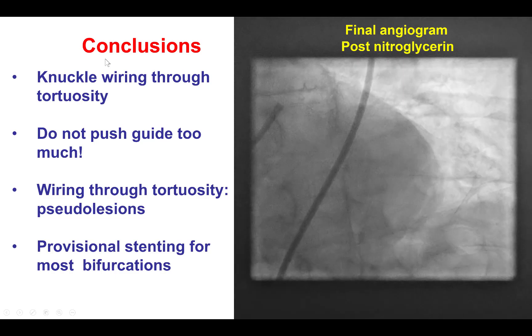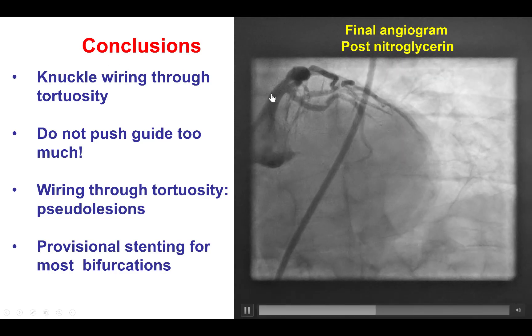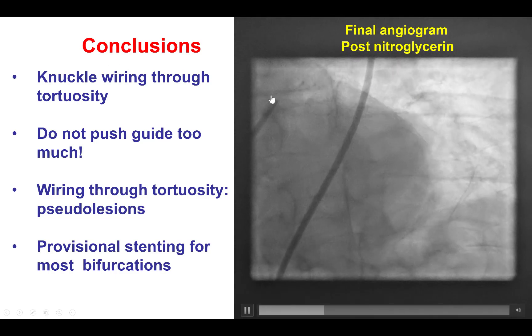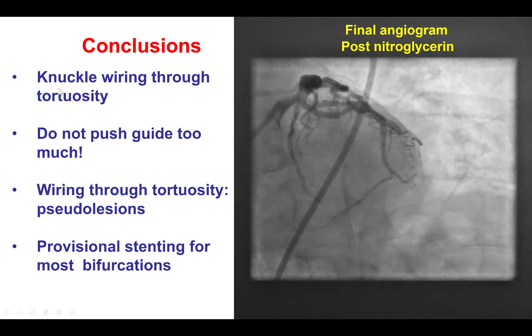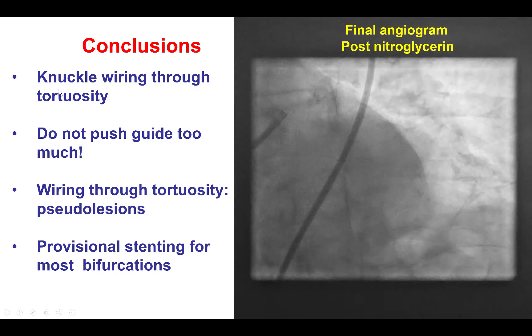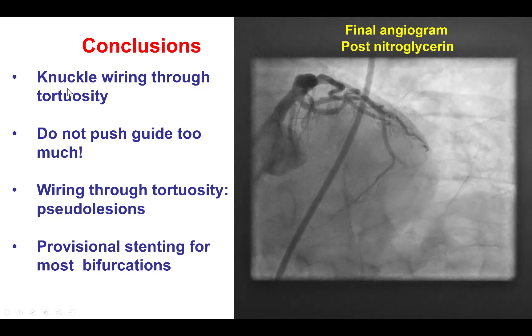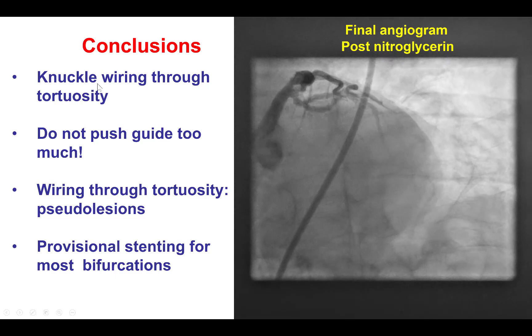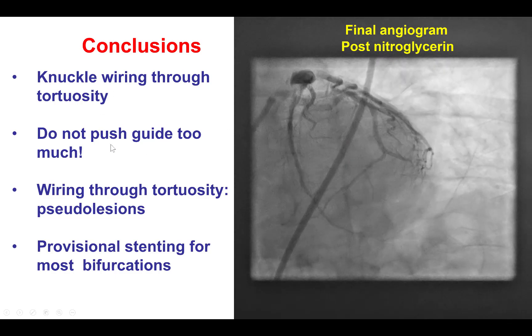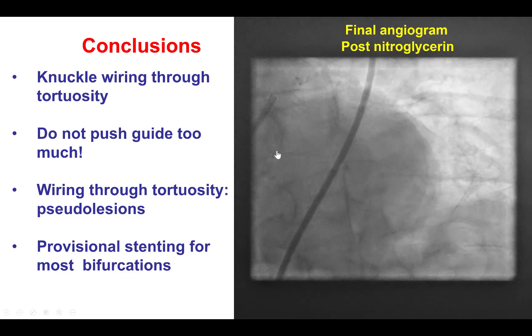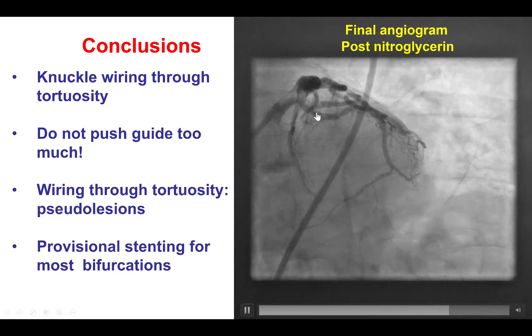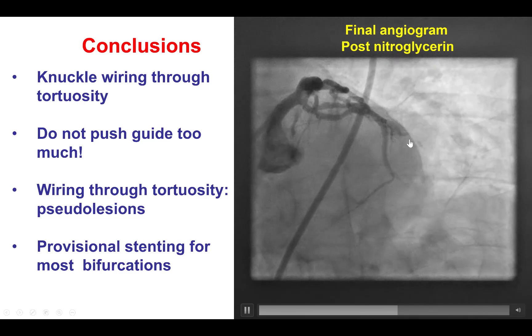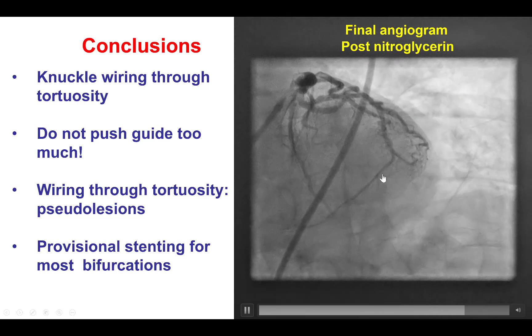This is an example of a case combining treatment of a bifurcation and significant tortuosity. It illustrates how a Workhorse wire can be knuckled to advance through tortuosity while avoiding side branches, and the importance of paying attention not only at the equipment we are trying to deliver, but also at the guide catheter and the distal wire position.